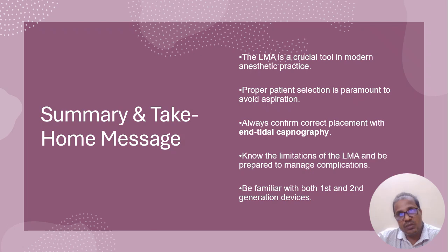At the last, we say that the LMA is a crucial modern tool for anesthesia.